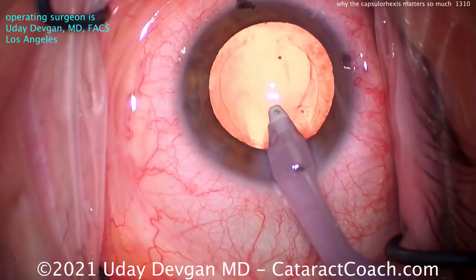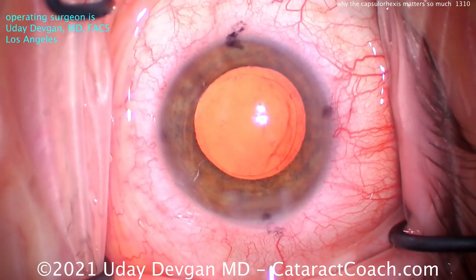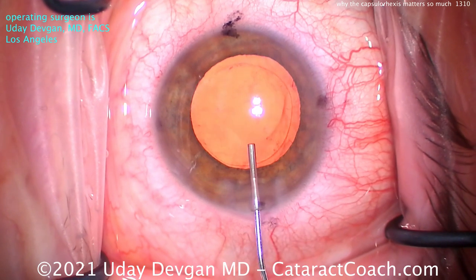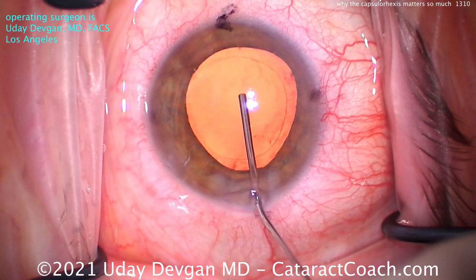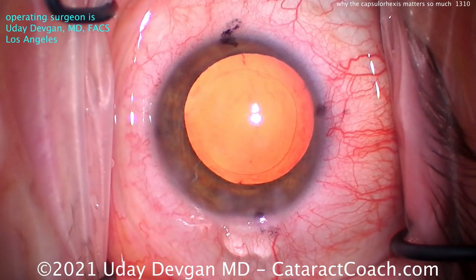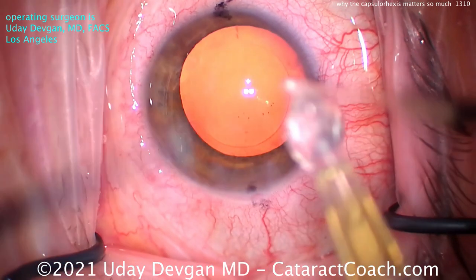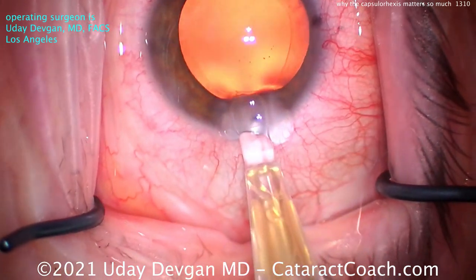So that's an important issue as well. You can see we cleaned up that capsule real nicely with a little capsule polishing. Let's fill up our capsular bag here. For our toric lens, we need to have the lens held not just in the correct anterior-to-posterior position with that overlap, but obviously we need to rotate the lens to the correct meridian.